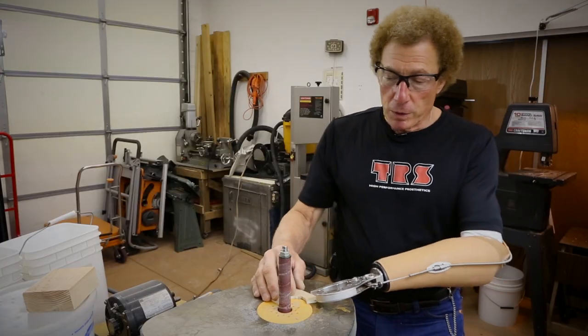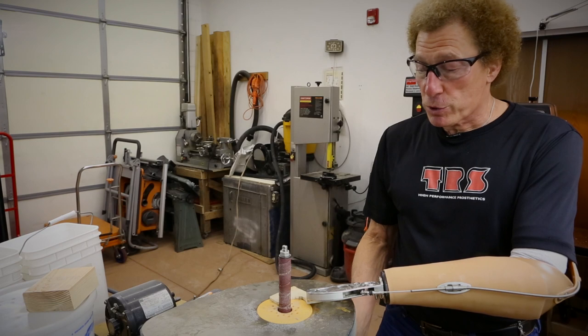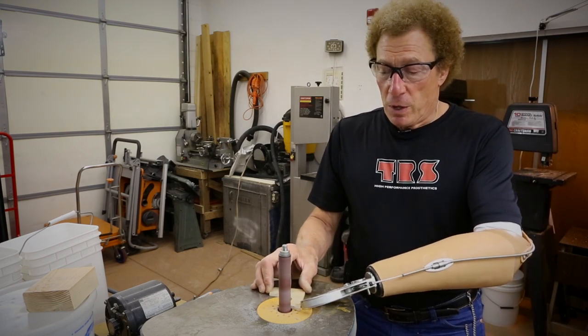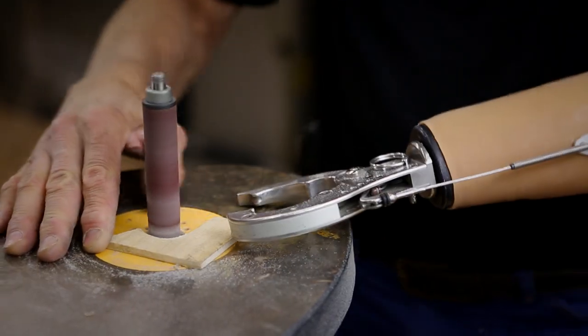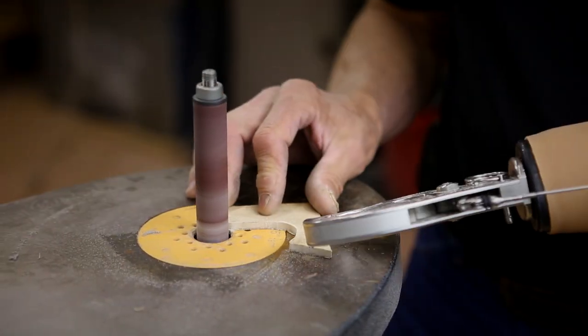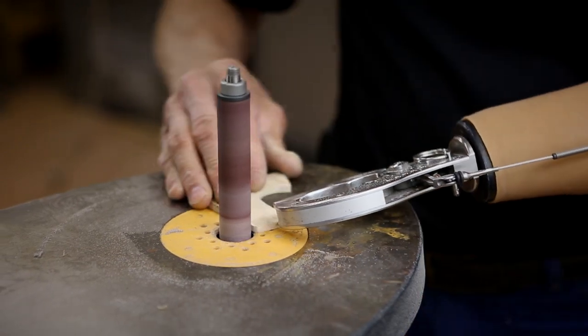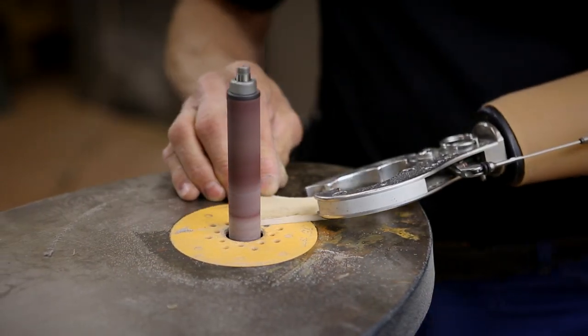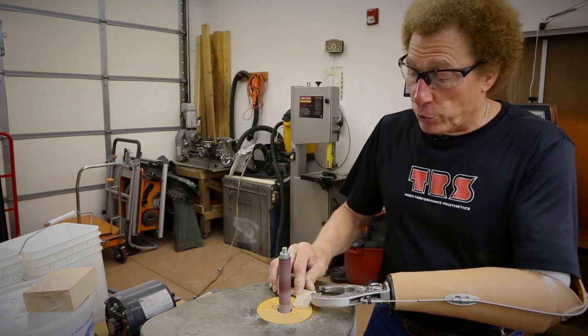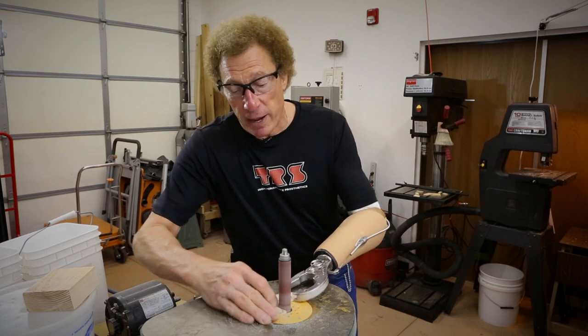This is a rotary and oscillating type of shaper, which is real handy for shaping certain kinds of things. Again, I'm just illustrating the functional use of a grip prehensor to control a shaper and control the wood — whether doing external surfaces or internal, more concave shapes.